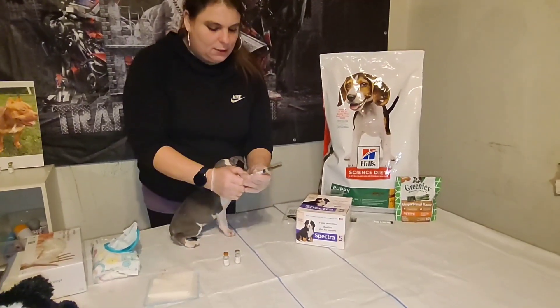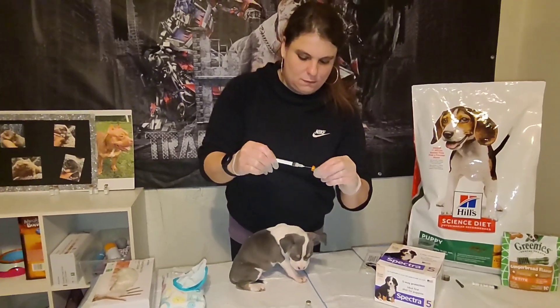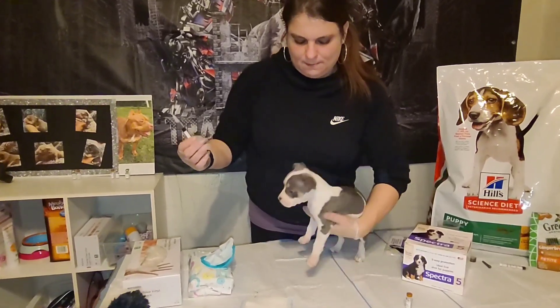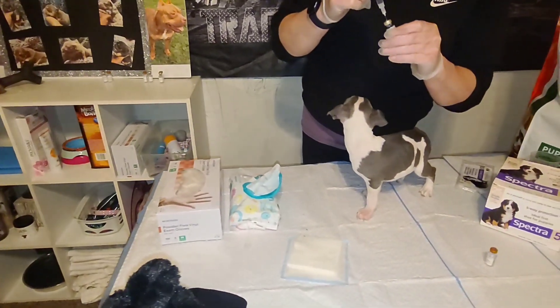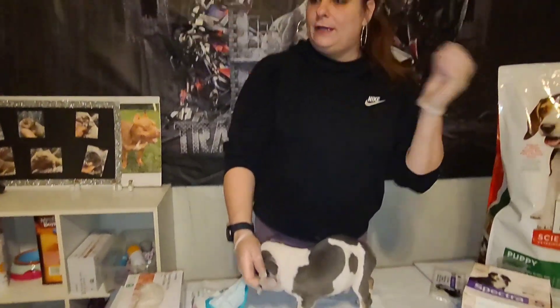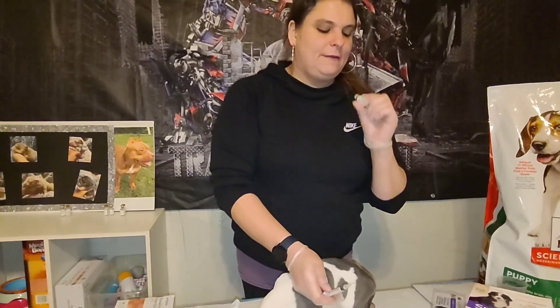Again, we're going to draw up the liquid, inject it into the powder, and shake the vial up until it turns completely into liquid so we can draw up one ml for the vaccine.